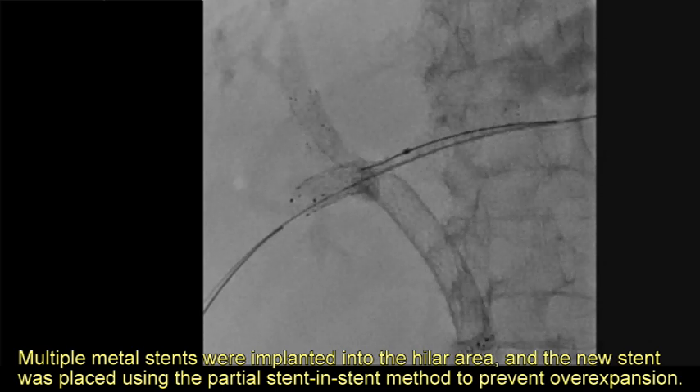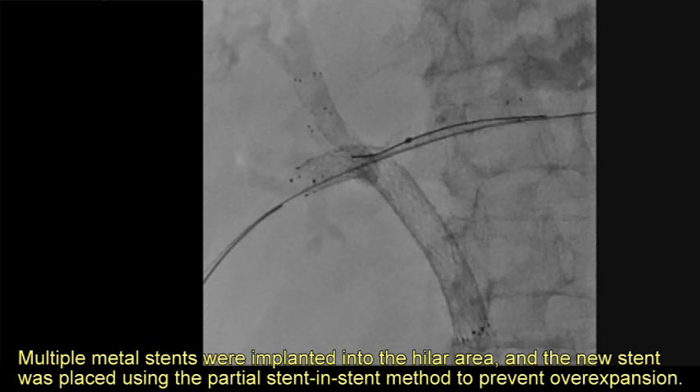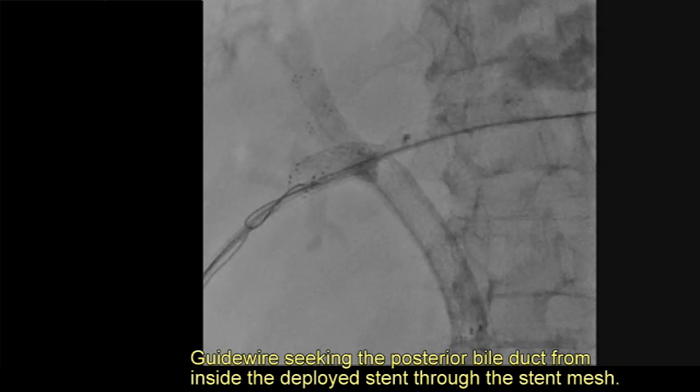Multiple metal stents were already implanted in the hilar area, so the new stent was placed using the partial stent-in-stent method to prevent overexpansion. A guide wire was then advanced seeking the posterior bile duct from inside the deployed stent, through the stent mesh.